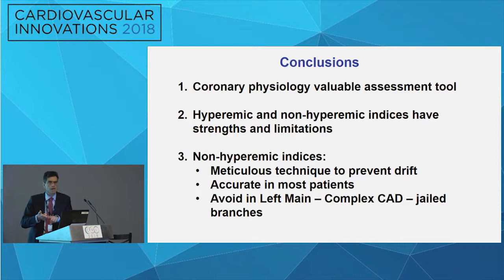The exceptions are left main, the very complex multivessel disease patients, and jailed side branches, in which I'll be more inclined to go and do FFR and give adenosine.